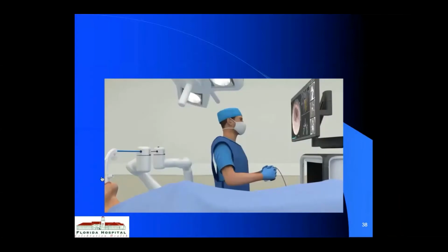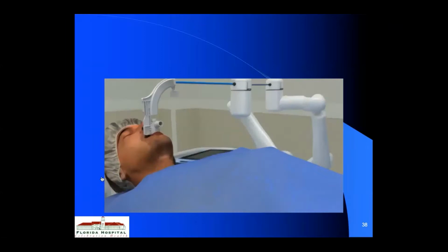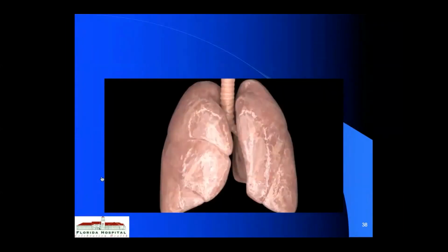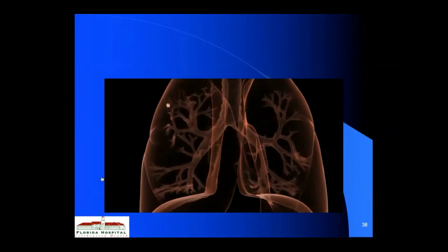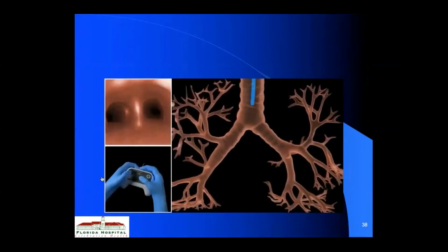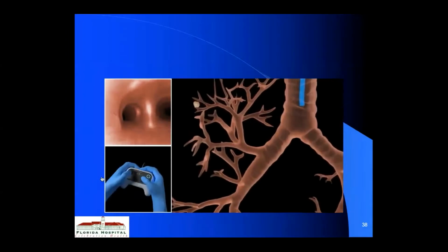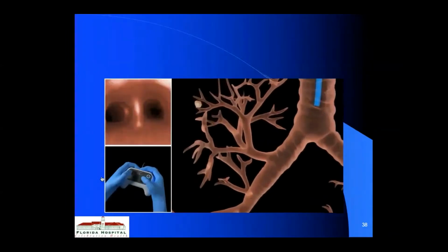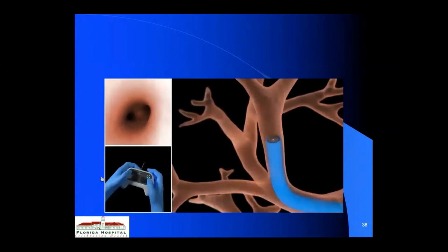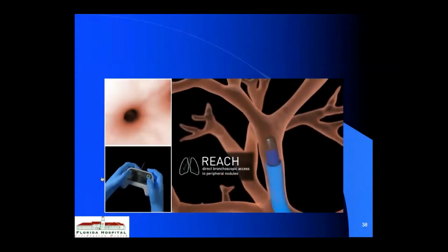It's a great video game, as you can see, but what this does, and this is how I think some of the surgeries in the future are going to occur, is where we can do image fusion, integrate the radiologic data into the robot, and then you really don't even need a surgeon. The radiologic data will guide the robotic arm to the point of the pathology with a little gain control there, you can see in the lower left.